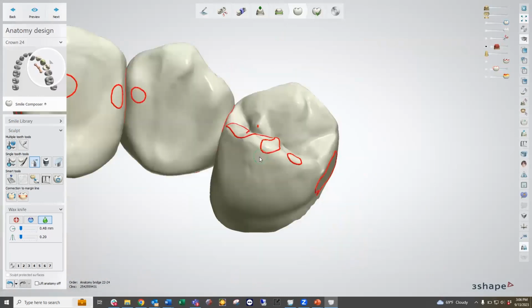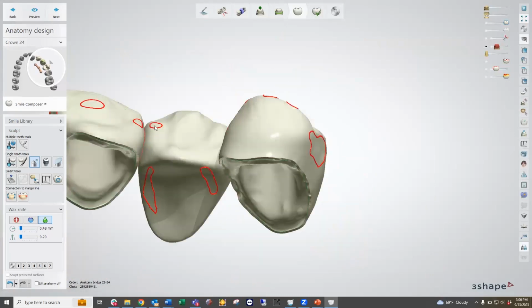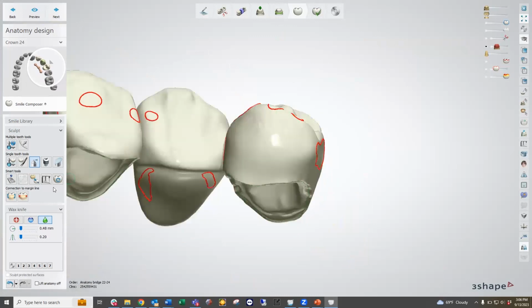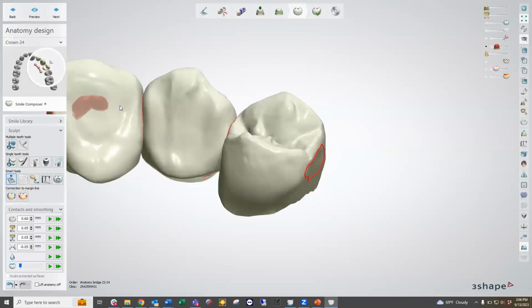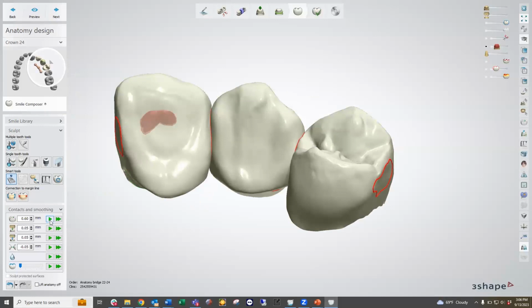Now, we do have a little bit of an area that's contacting here and here, as well as here with our opposing. So we can go to our smart tools. Now we can use that desired distance to antagonist. We can hit the play button. And that play button just applies to the single unit that we have. But if we have multiple units, we can hit the double play button, and that applies to all units. So here we have a kind of battle between minimum thickness and distance to occlusion. So I always allow the distance to occlusion to go first, and then I hit minimum thickness to apply that as a secondary option.